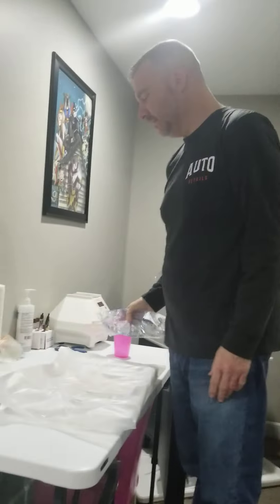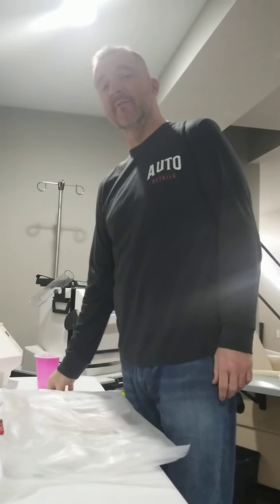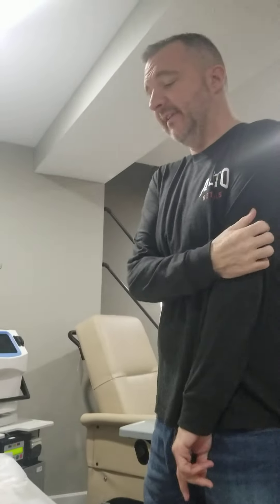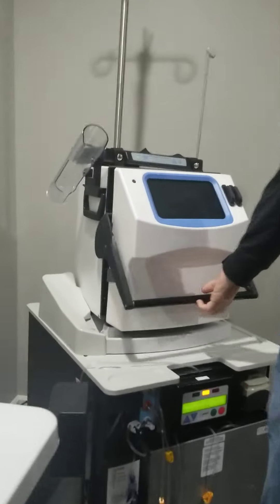Going to do another dialysis video today — seems like people liked the one yesterday. I'm sick of doing the same thing over and over again so I figured I'd show you guys what I do. Today I'm just going to show you the setup. Yesterday I showed you the treatment but not the half hour of work that goes into it before I can even start treatment.